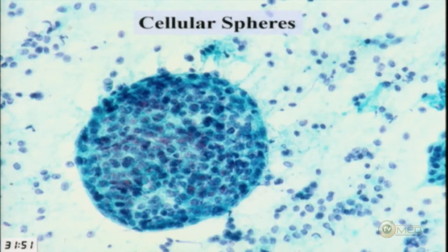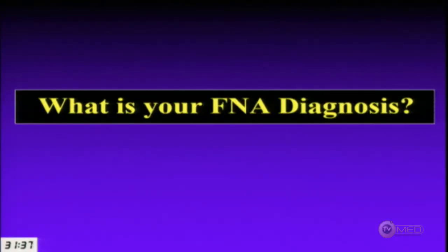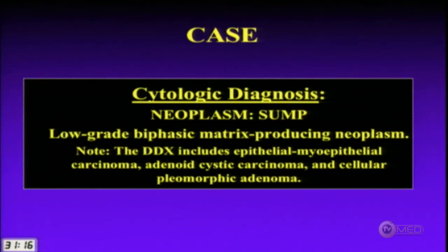We do have occasional large spheres of cells, which is one area that raises concern for adenoid cystic carcinoma. This was signed out as neoplasm, uncertain malignant potential — low-grade biphasic matrix-producing neoplasm — with a differential including epitheliomyoepithelial carcinoma, adenoid cystic carcinoma, and an unusual cellular pleomorphic adenoma.